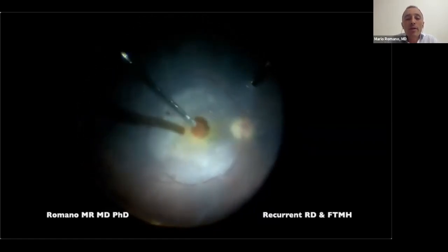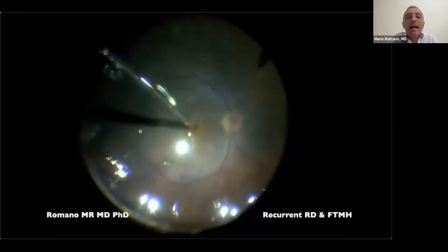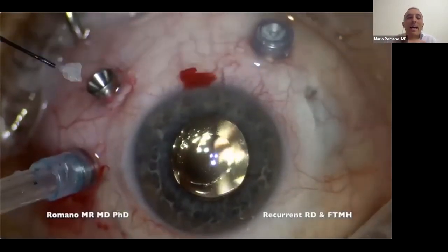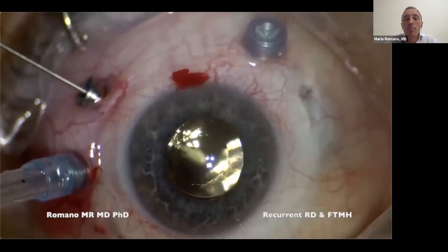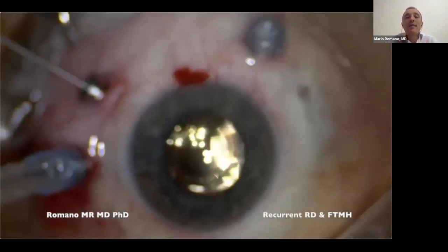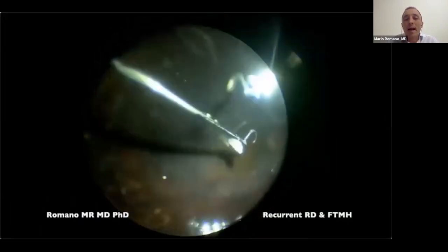So I was putting human amniotic membrane. It was dried as much as I can, and I was putting it just as a plug. You know that when you have a macular hole, you have a stromal side of the human amniotic membrane that you put towards the pigment epithelium because it's sticky and stays there, and the epithelium towards the retina. In this case, I was not caring at all. I wanted just to get a plug.